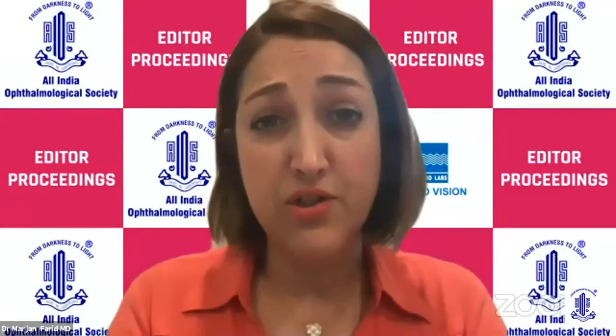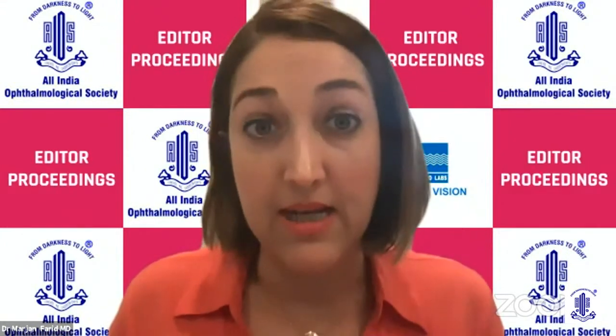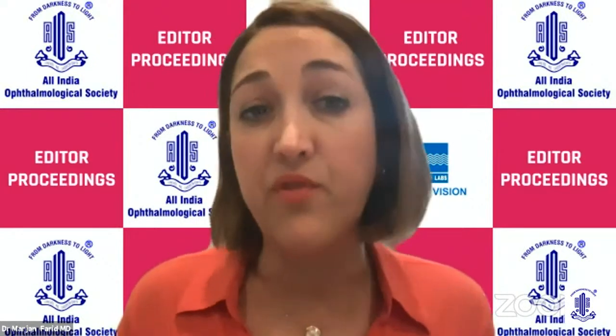No, I agree. Certainly there are different types of topography, tomography that we can do, Scheimpflug, but I think ultimately they can all give us an error if there is significant tear breakup time that is rapid and irregular. So absolutely, in cases where my hands are tied and I can't improve the surface beyond a certain point, then of course I do Scheimpflug topography as well to really get the best I can get. But those are then patients that I may not select for multifocal.